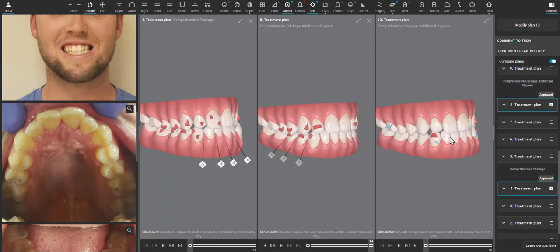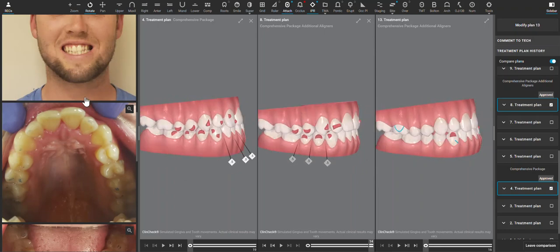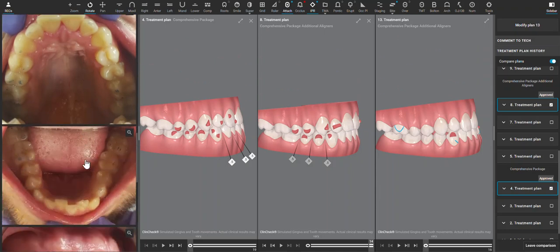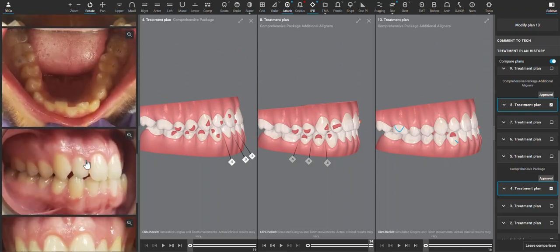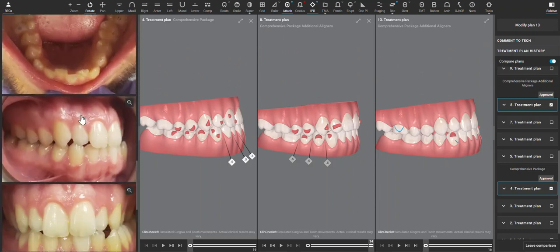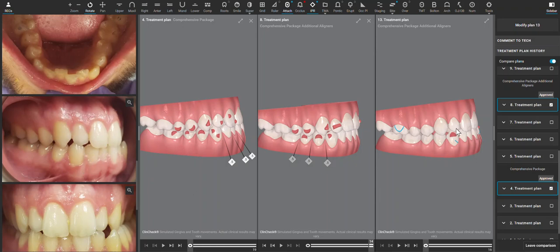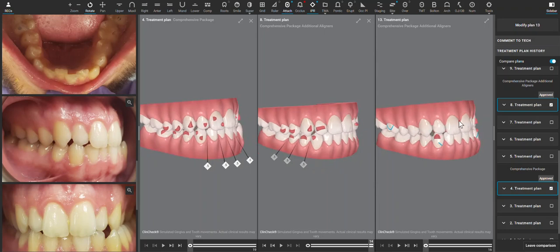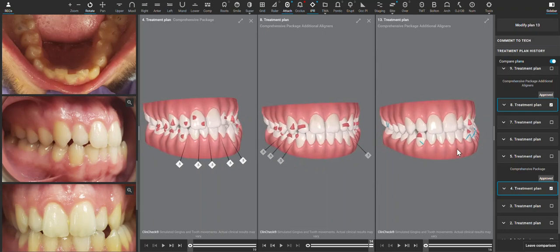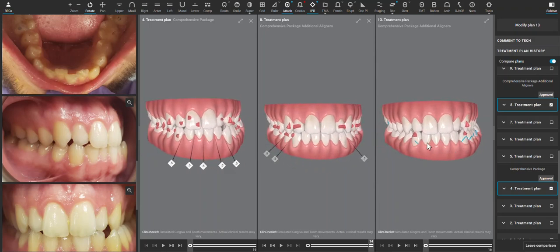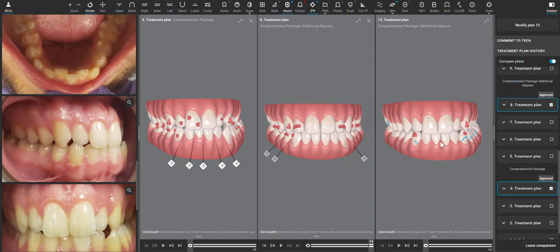I pulled up the patient's photos to show that this is not a teenager. The next thing we need to be evaluating is what can we do buccal-lingual in the anterior to resolve this anterior interference. The next set of solutions are to do as much lower anterior IPR as possible and/or set up for restorative around the undersized lateral, so creating some space on the upper arch.